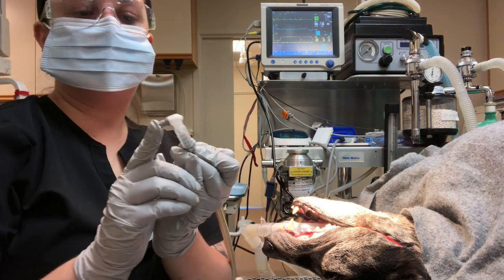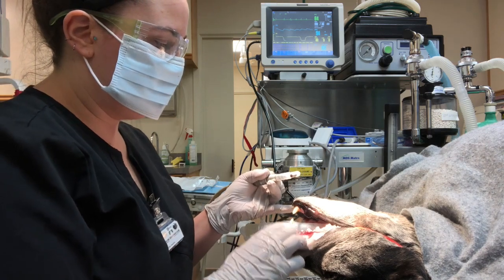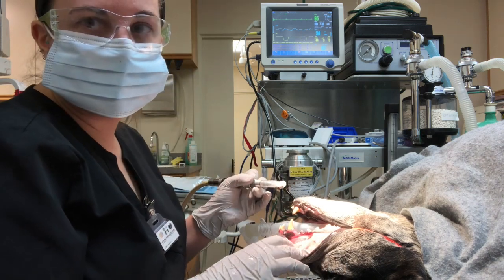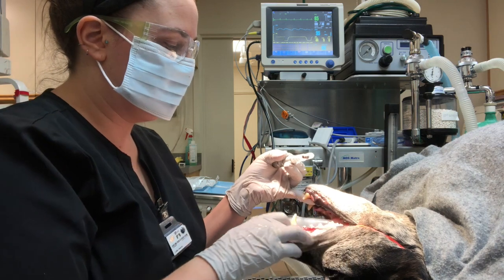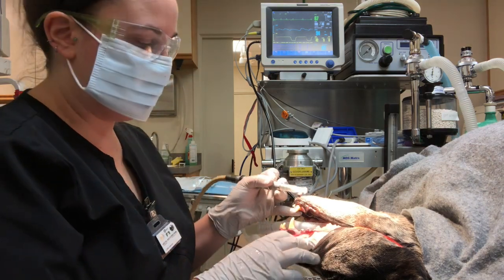And you want the cup to flare just a little bit. You don't want to put too much pressure on it. And what this is doing is it's getting the microscopic pieces of calculus off and bacteria to leave you with a nice polished surface on your tooth.